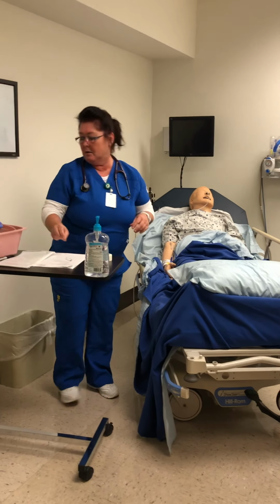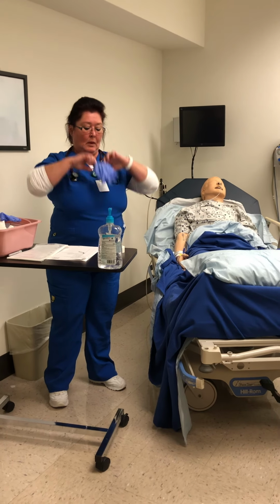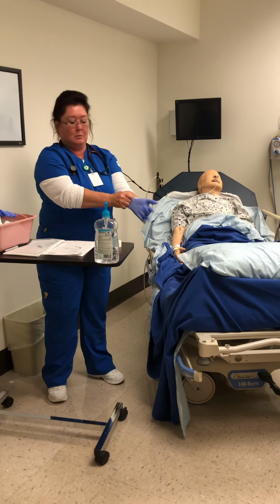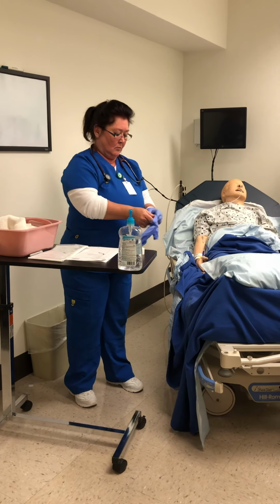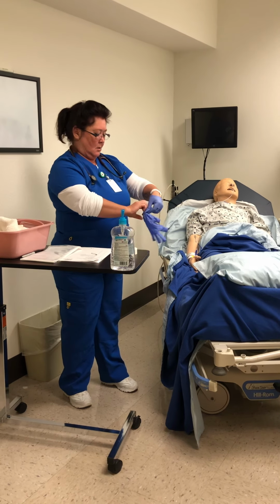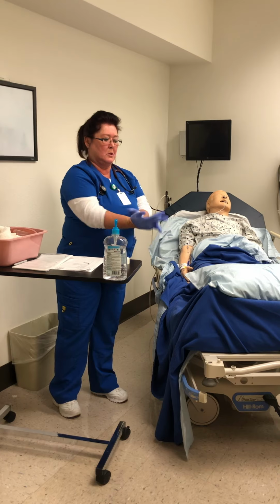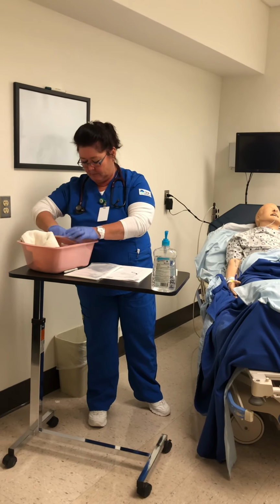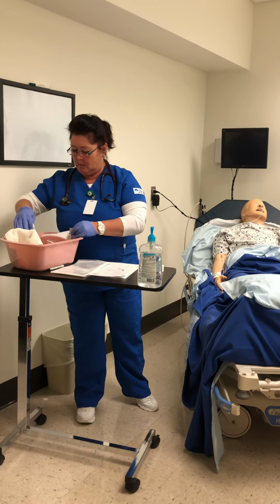I am going to don my gloves again. I'm going to get an alcohol prep ready. And my gauze.